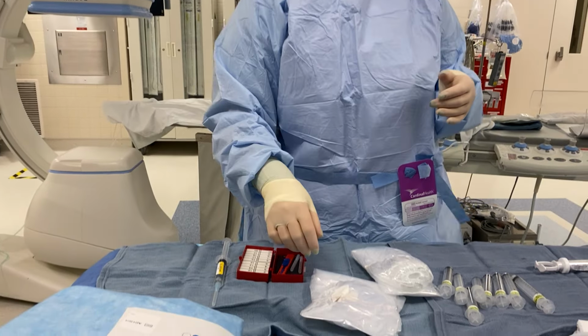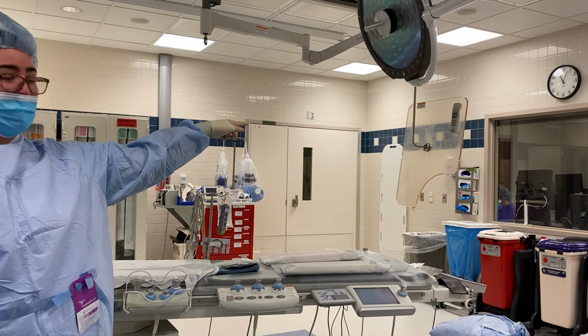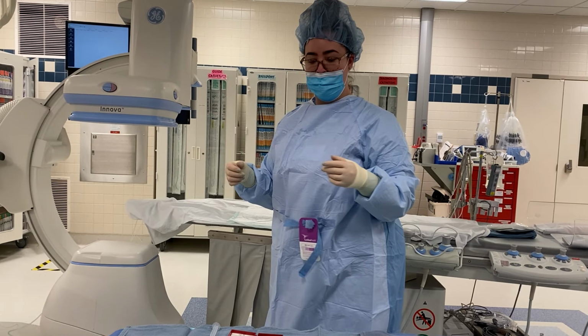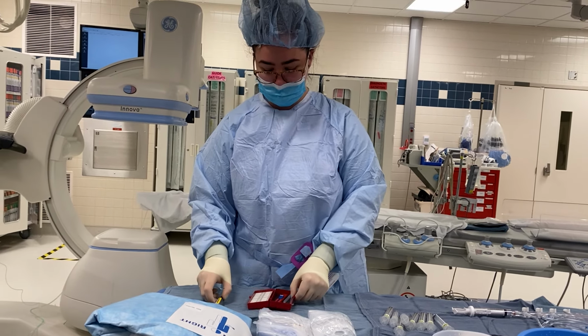and remain sterile. The next one is the shield cover, and this is going to go on our x-ray shield right there, which during the procedure is going to get moved right up here. And with it being covered, it allows the doctor to move the shield around while still remaining sterile.